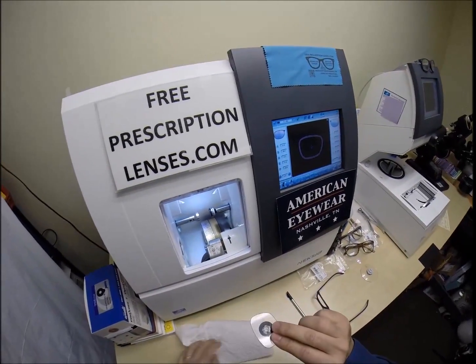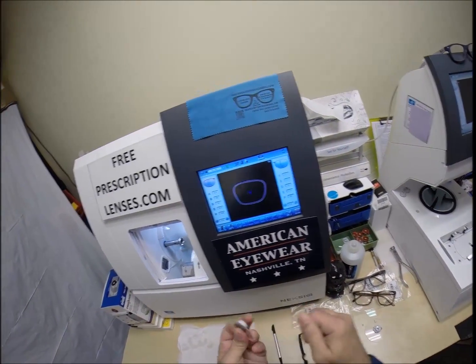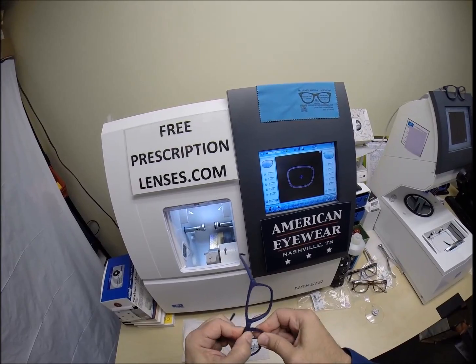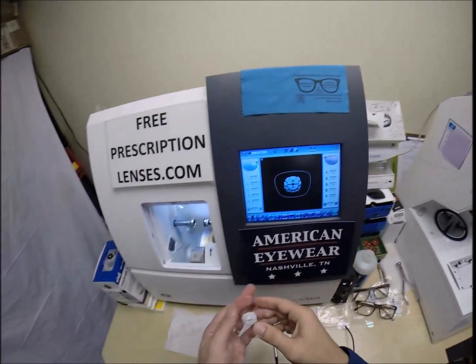So I just want to dry your lens off. Let's make sure there's no more optical debris around the edge of your lenses. Let's see if it fits first time around. I'm going to tuck it in at the outside corner first using my thumbs, press down at the nose, and it snaps right in. I'm going to do the same thing now for the left lens.